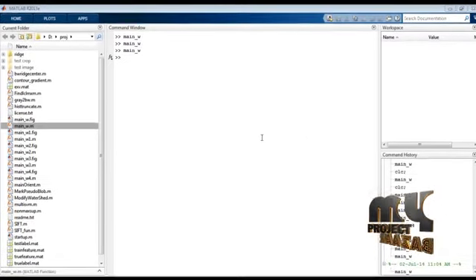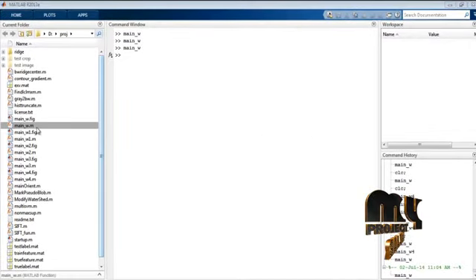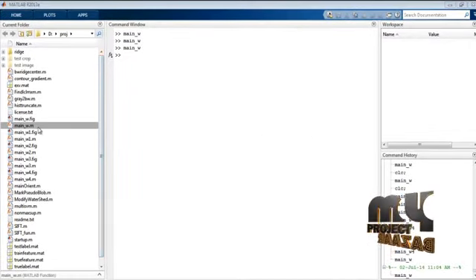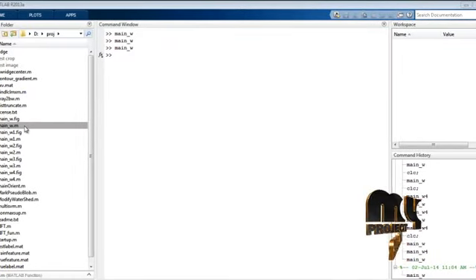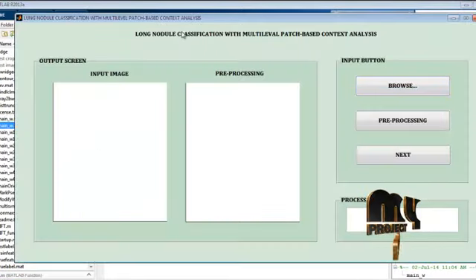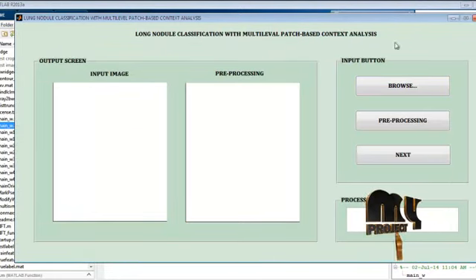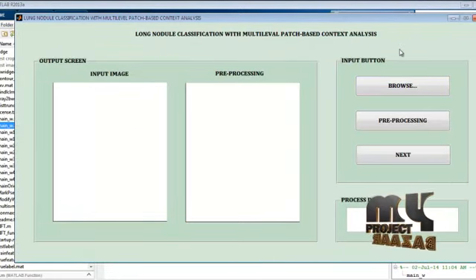Next, we will see the output for the project. The main file is run to produce the output for lung nodule classification with multilevel patch-based context analysis.